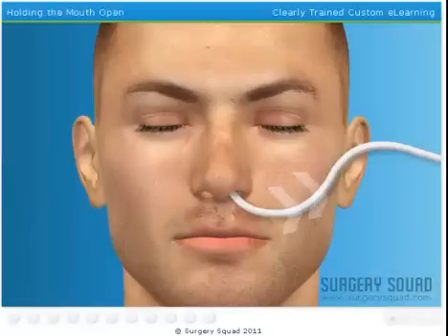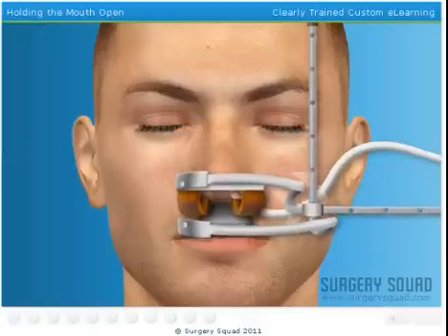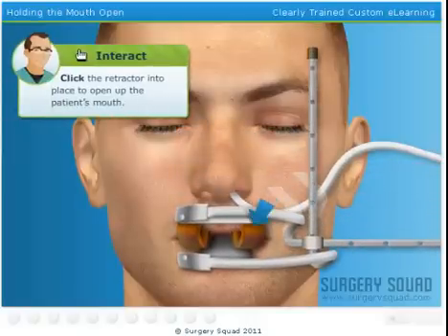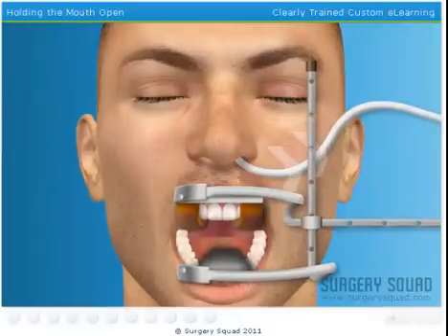We need to get our patient's mouth open wide so we have room to work. To do that, we'll use a special mouth gag retractor that opens the mouth, depresses the tongue, and locks into position. Why don't you take a crack at that? Great job! That should give us plenty of room.